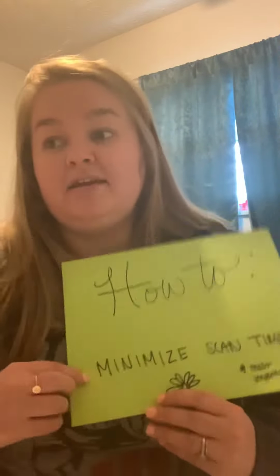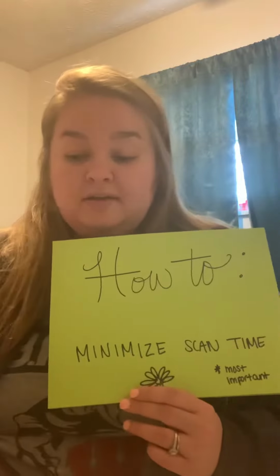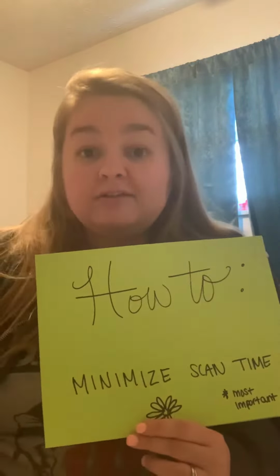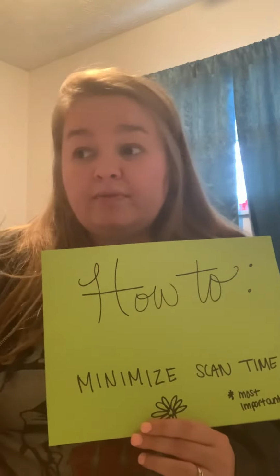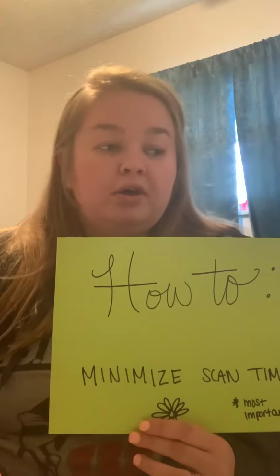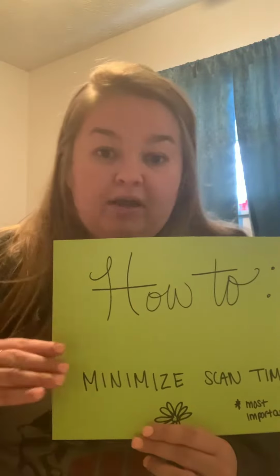more sequences that you can complete and send to the radiologist. Another reason why scan time is so important is because the longer the scan, the more opportunities the patient has to move around and cause motion artifact and just ruin the whole set of pictures. So the quicker the better all around for the patient.